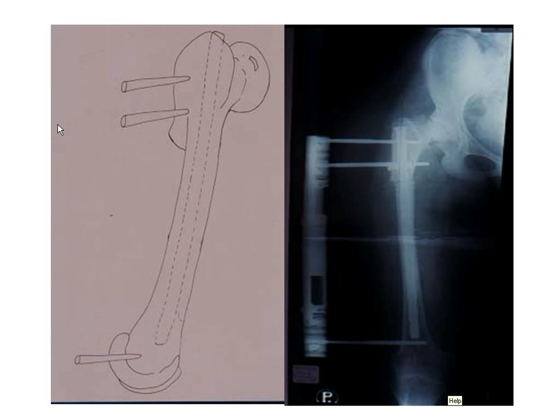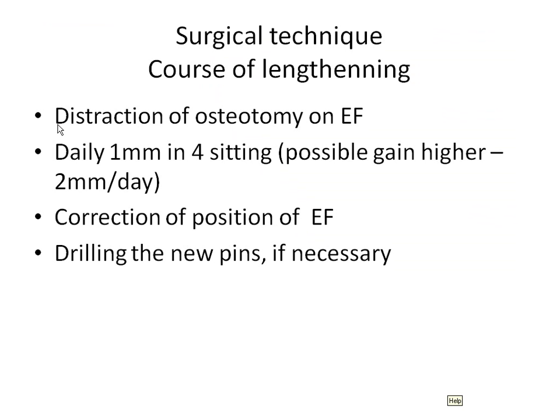You can see that we start with femoral lengthening because it has the bigger amount of complications. We find a place for application of the upper part of the external fixator in the trochanteric massif, and distally we always find a place for minimally one screw, which can allow distraction, and when we have enough space we can add more screws. So the surgical technique was relatively clear.